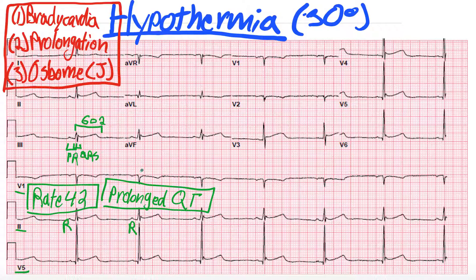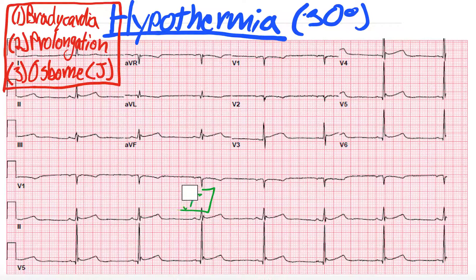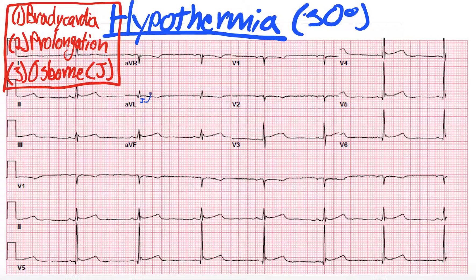Then we have this most well-known, almost pathognomonic concept, which is Osborne waves. I'm going to erase all this, as it's more straightforward and easier to see on different EKGs, and then we're going to hone in on elevated J points. So what is a J point? A J point is the point at which the QRS terminates and the ST segment starts. So in AVL, where you don't see an elevated J point, I'm just going to label the J point — it's right here, this niche where the QRS ends and the ST segment starts.